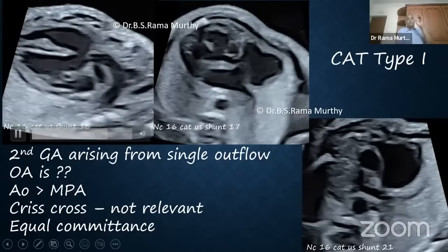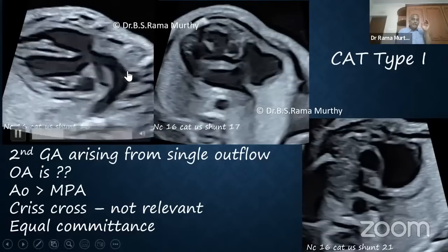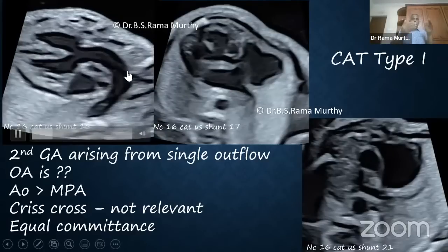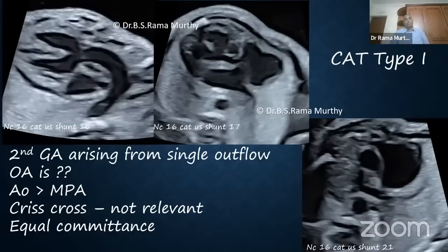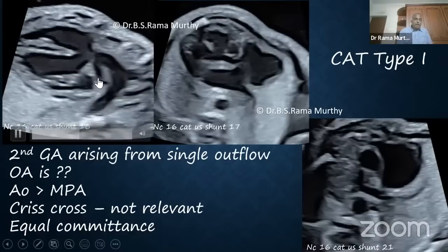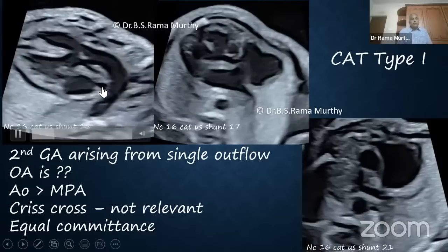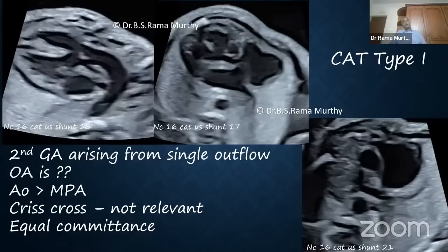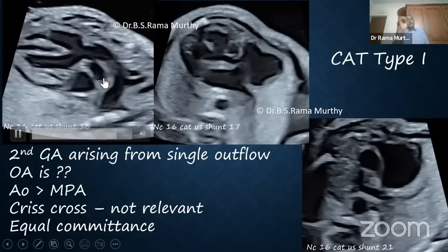In my efforts to look for a second artery, as I'm going from the four-chamber view into the LVOT, from the four-chamber view into the five-chamber view, with translatory and rotatory movement, I suddenly find a smaller artery coming from this big artery posteriorly. So that to me could be the pulmonary artery. And what should I show of this artery to nail it and say that this indeed is the pulmonary artery?